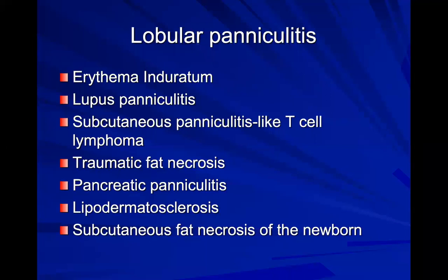So switching gears, we're going to talk about lobular panniculitis, and this is a much more difficult topic because the differential is more broad. Because this review is kind of an introduction to dermpath and how to approach slides, this is not an exhaustive list by any means, but there are some features that will help you distinguish one entity from another, and there are certainly ones that are differentials of each other. So we'll try to point those things out.